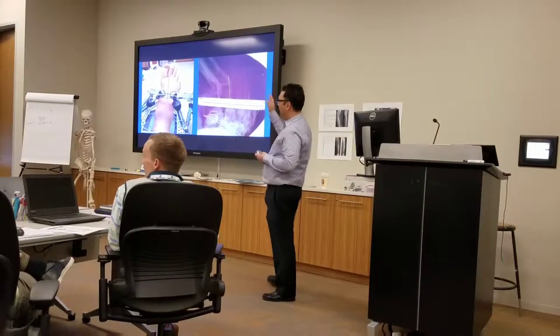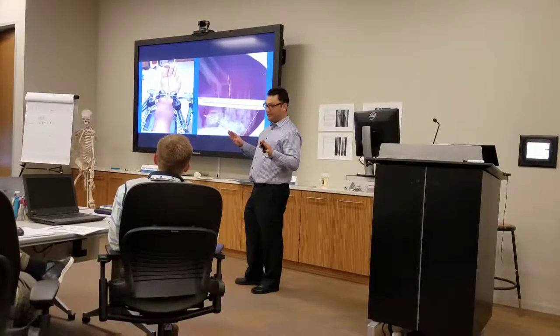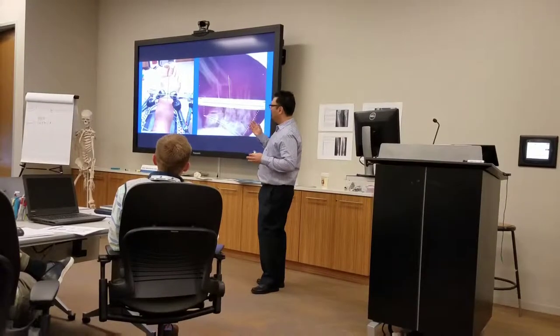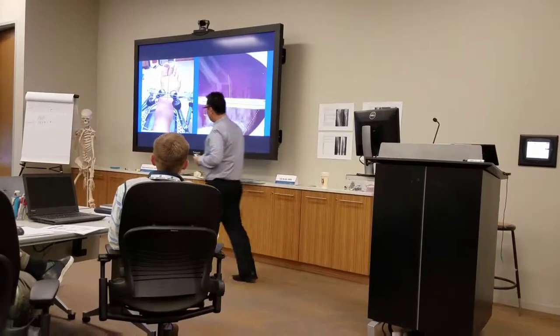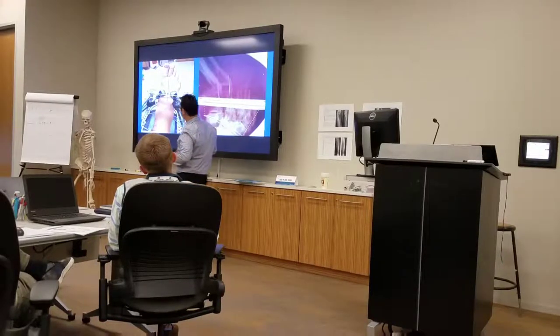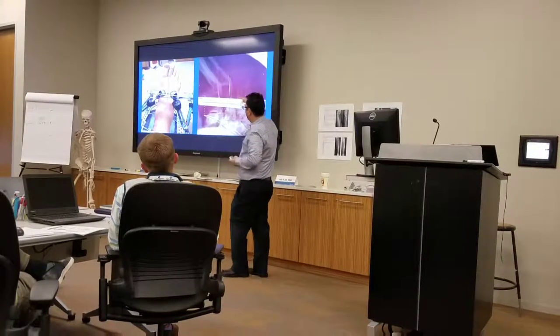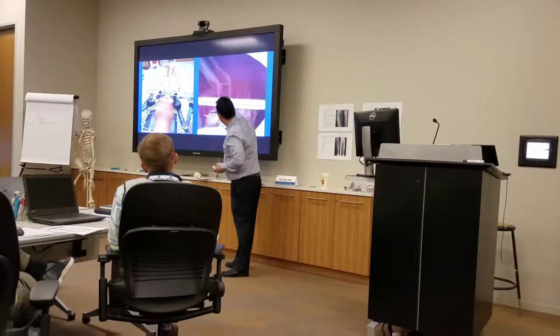All right, a lot of you are used to looking at the saw bones, and many of you have looked at x-rays as well. I want you to start getting used to measuring it off the foot and the x-rays. As you can see here, you can measure the foot. I know that the second metatarsal is here because I took an x-ray with a wire over there, and you can draw a line on that. You can see how you're measuring with the goniometer how much medial tilt forward you have. Here it's done off the x-ray. This is a bisection of the foot. This is a bisection of the second metatarsal.